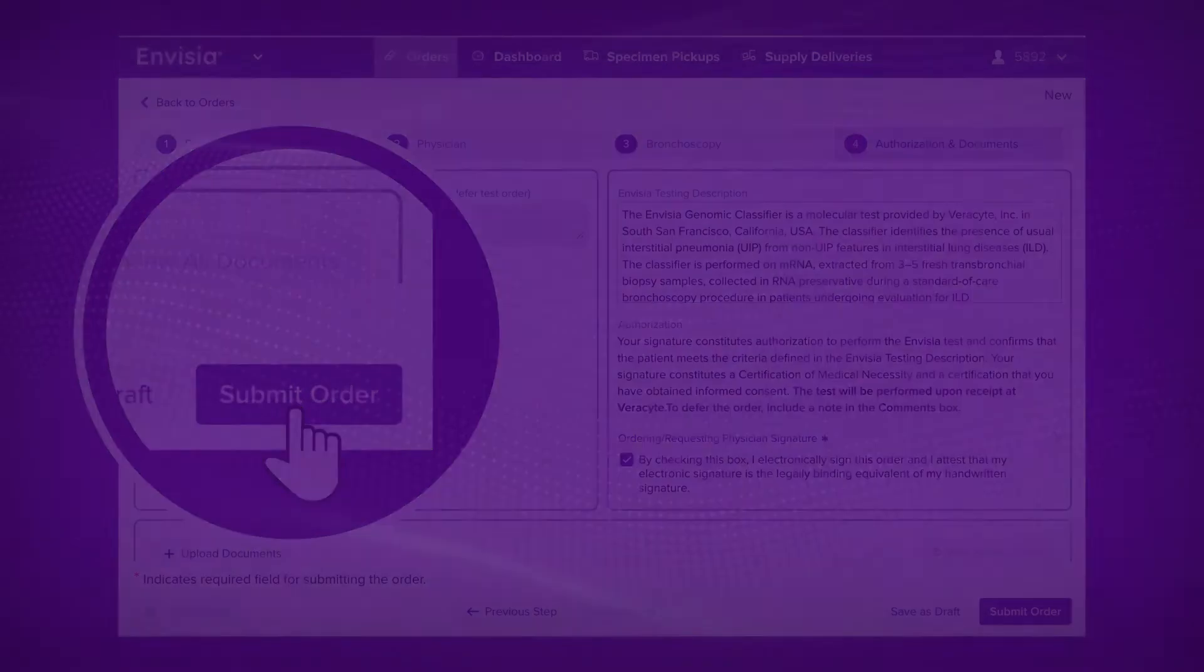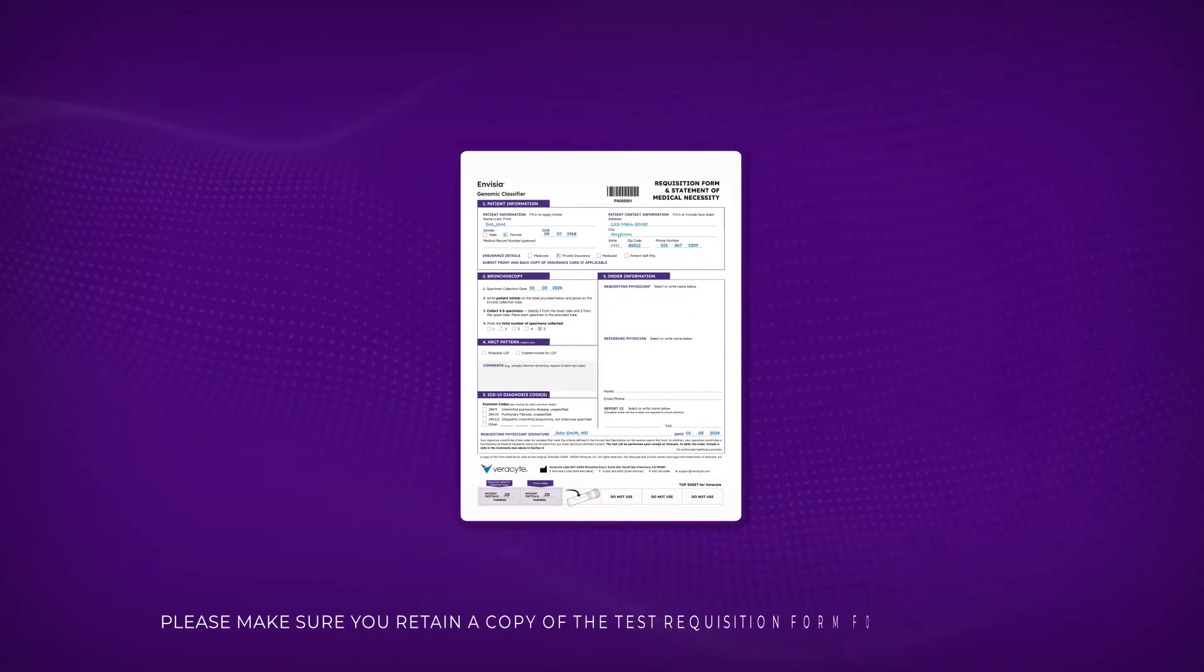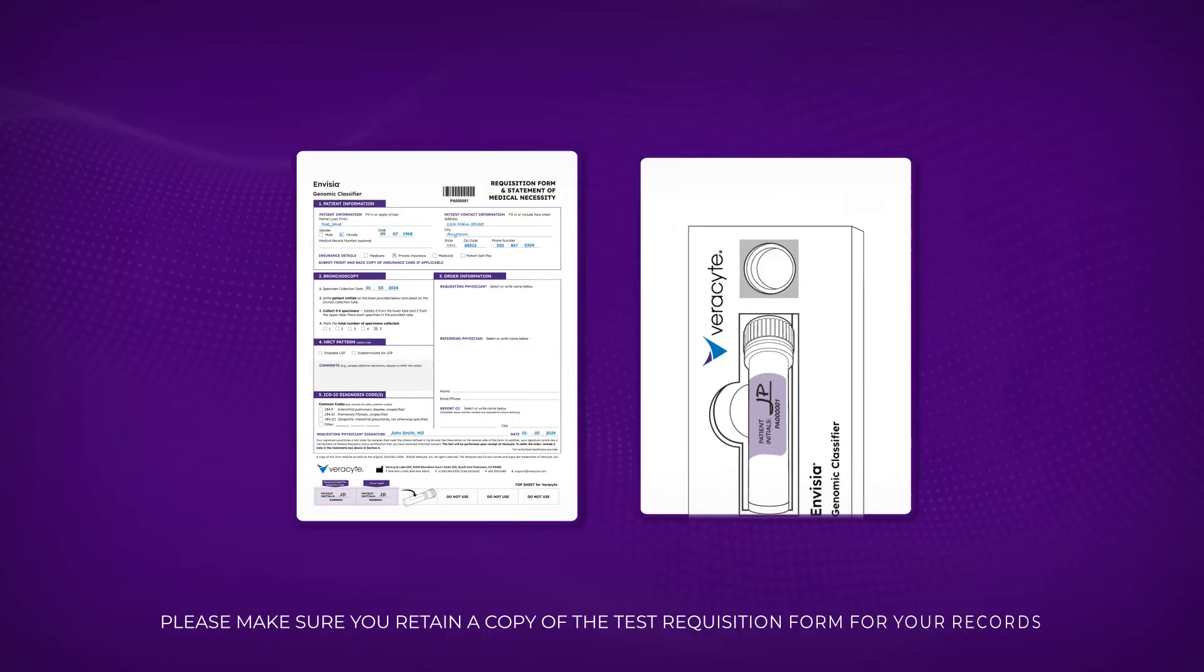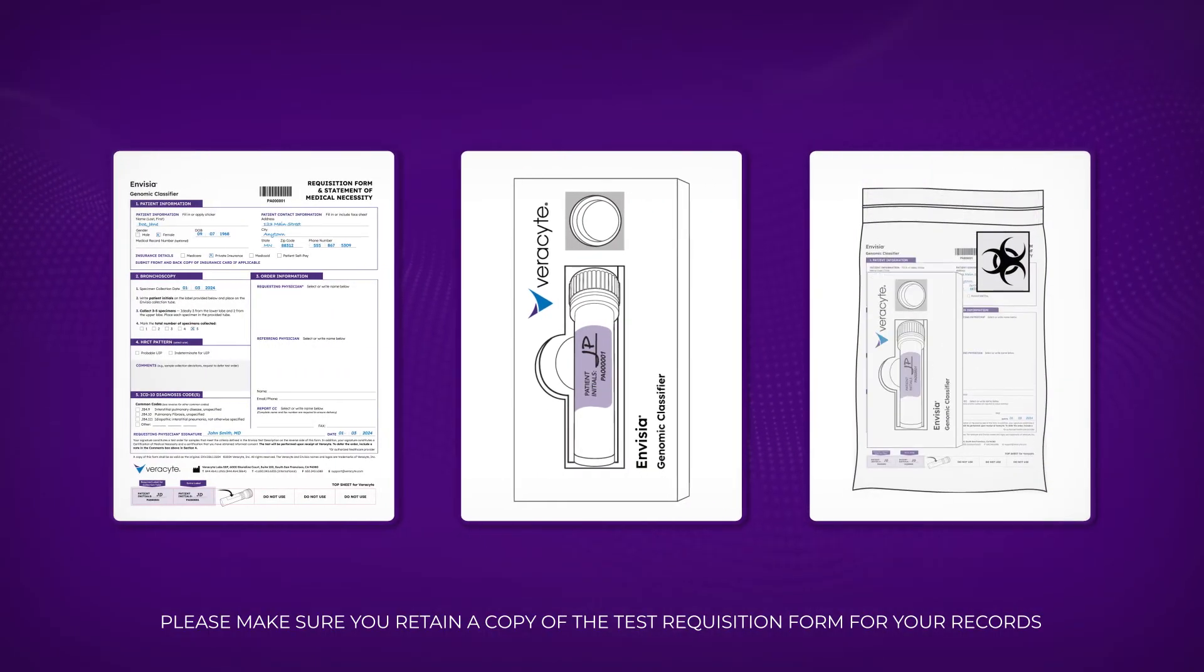Place the signed test requisition form or the patient verification card into the biohazard bag.